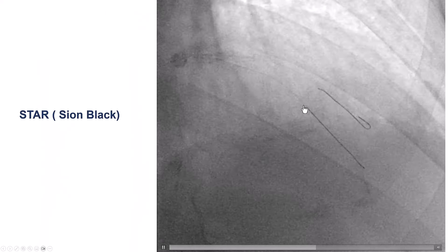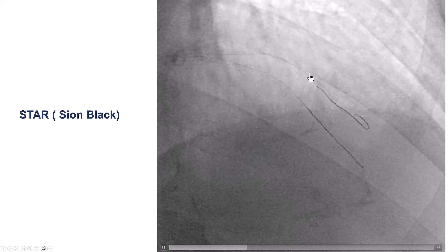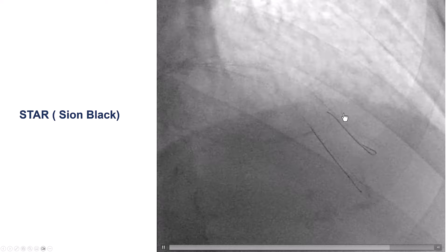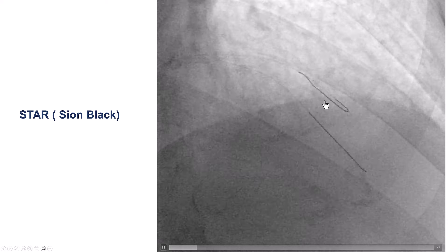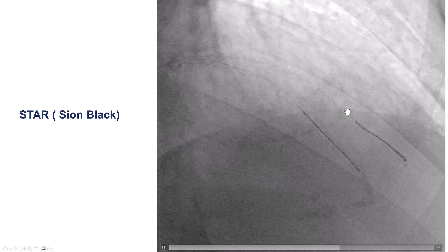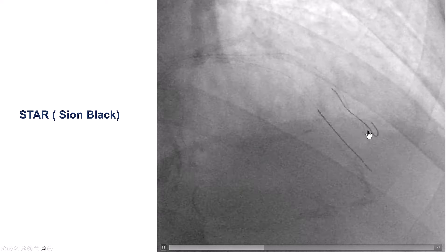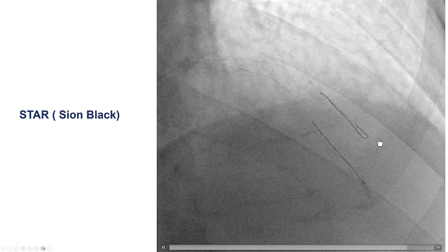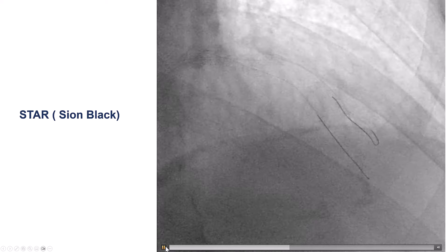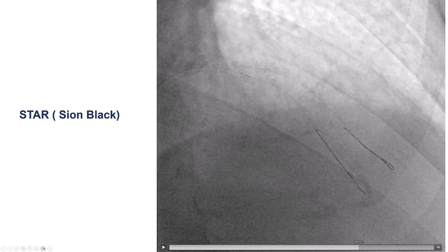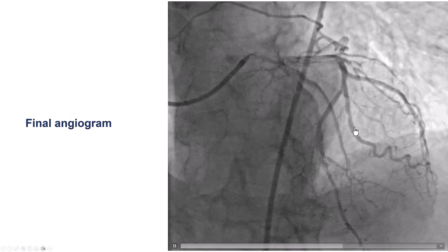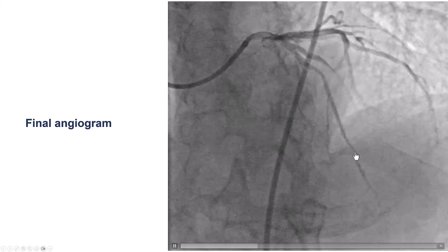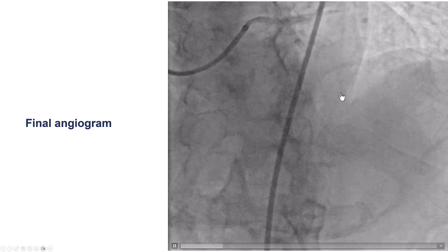So what to do? At this point, there's not much we can do except get some antegrade flow, and to do that we need to fenestrate those branches — this is done using the STAR technique. What STAR simply means is that we take the polymer-jacketed wire, a Sion Black in this case, and with the loop at its end we advance it distally. We see antegrade movement, and then there's a sudden decrease in the size of the loop — the loop is fairly large initially, but as we push it down the loop becomes much smaller, which is a sign that we have entered into the distal true lumen. The angiogram confirms this: we have good flow now into the second diagonal, and we can see the area of dissection caused by the STAR technique.